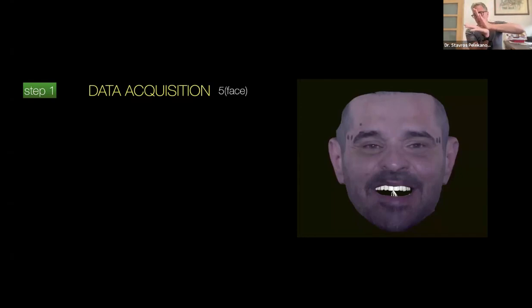Patient was biting and we needed to spend I don't know how much time. Nowadays, 5 minutes and the whole workflow of occlusal adjustment is finished, because we do a lot of recordings. So again, pictures, step number 1, intraoral scannings, X-rays, motion, face.